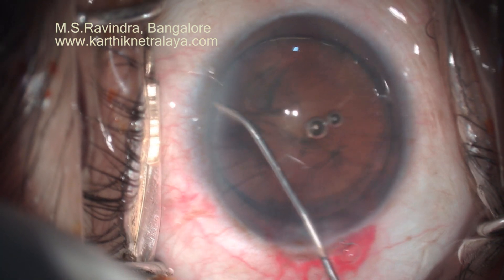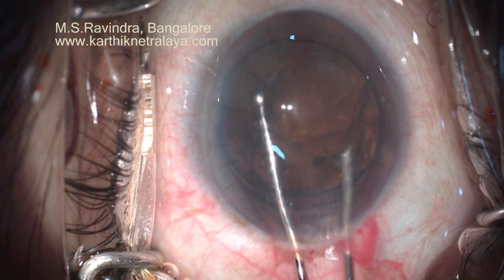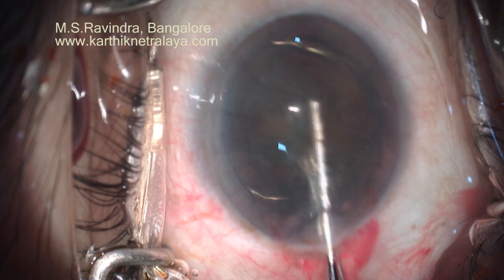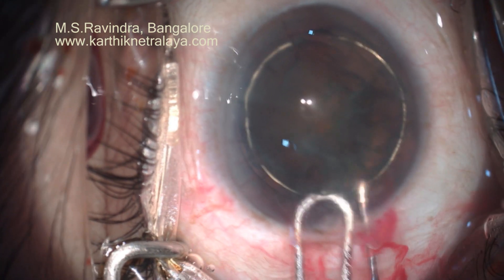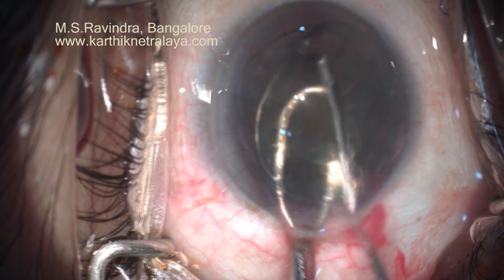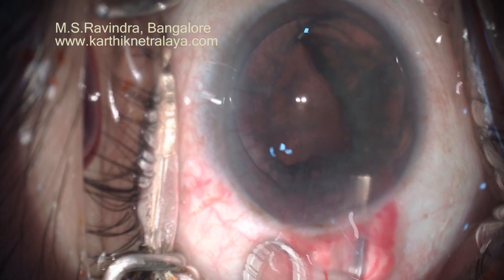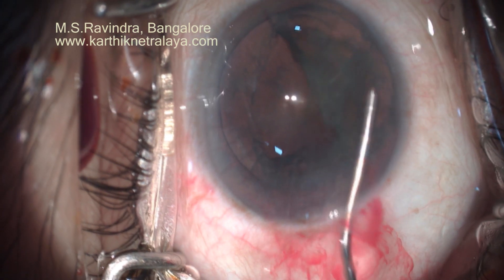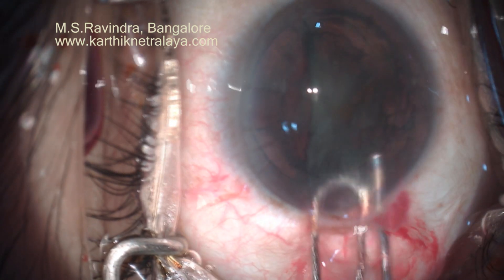The nucleus-epinucleus mass is rotated and the nucleus is bisected before it is visco-sandwiched out of the eye. The 27-gauge cannula that supports the nucleus in front is continuously injecting viscoelastic so that rub against the endothelium is avoided. Endothelial loss is least in this technique when compared to any other technique of cataract surgery.